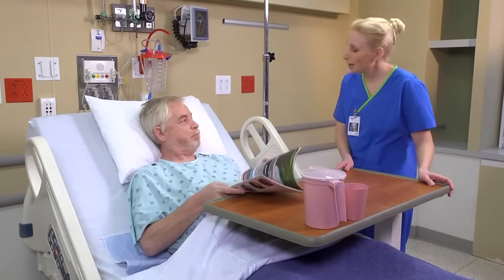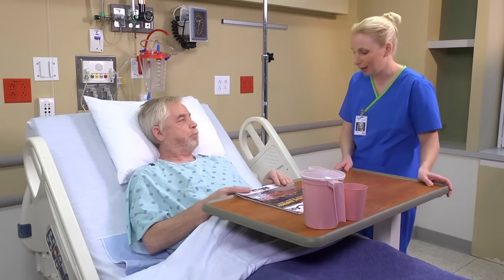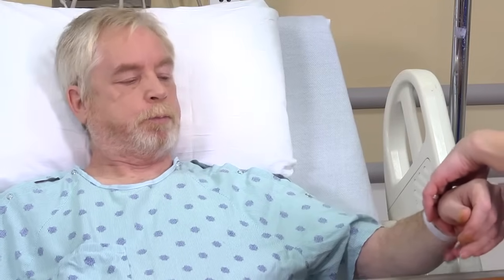Good morning. Good morning. My name is Becky. I'll be the nurse working with you today. Can I go ahead and see your armband? Can you tell me your name and date of birth? Derek Portman, 12-29-51. Okay, thank you.